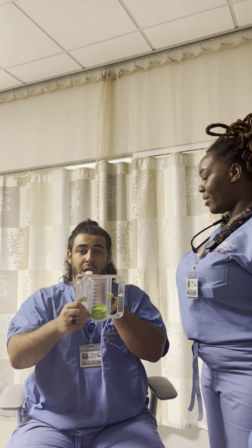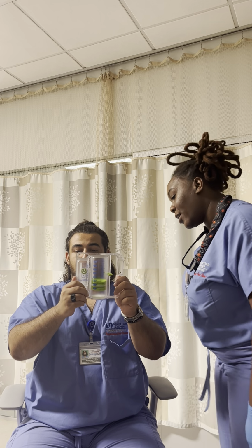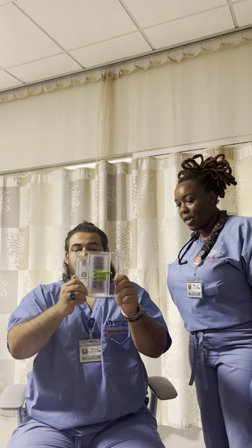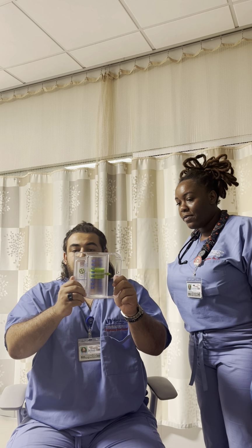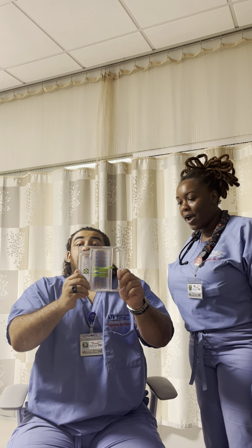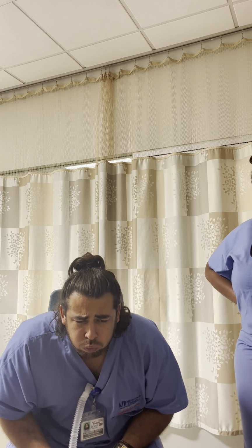Okay, make a tight seal. Don't occlude, inhale, doing great. You're doing great. Now you're there, hold it for 1, 2, 3, 4, 5, 6. Good job. Great effort.